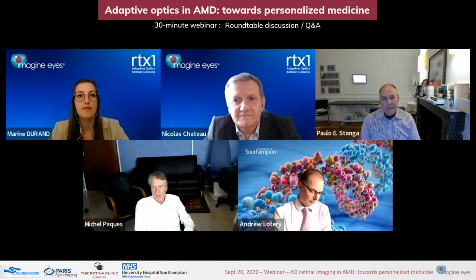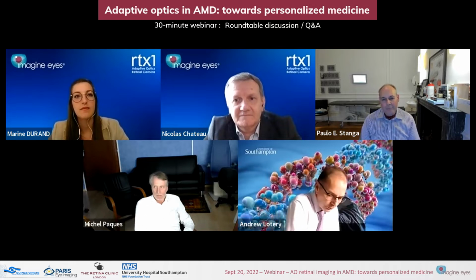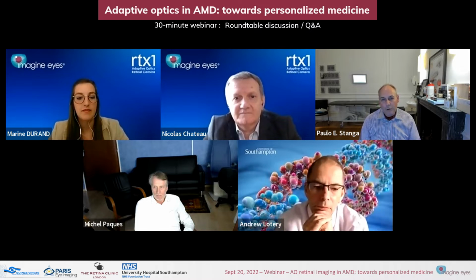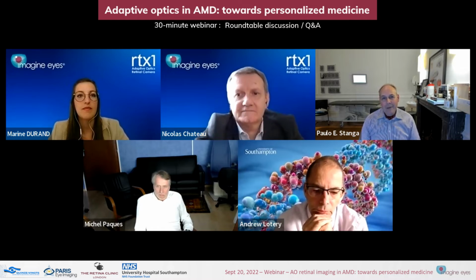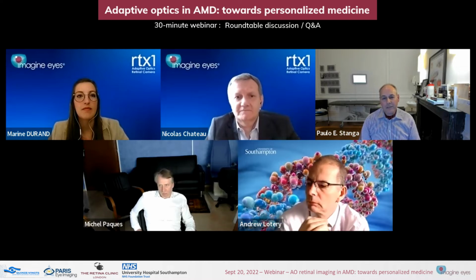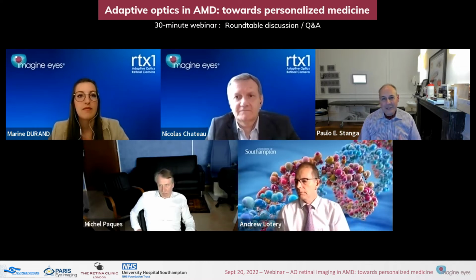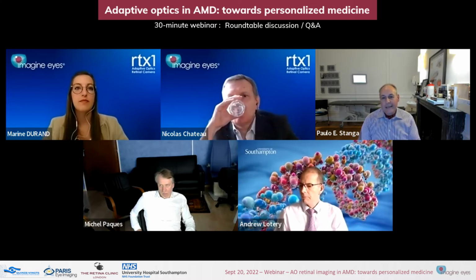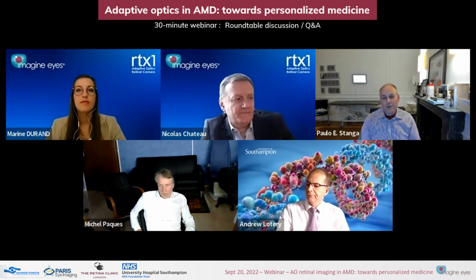Well, I believe that adaptive optics imaging can contribute new and complementary information to other ophthalmic imaging techniques such as ultrawide-field imaging, fundus autofluorescence, and even high-resolution OCT. All of these technologies should form part of a comprehensive eye examination, in my opinion. The goal is to reach diagnosis as early as possible. Adaptive optics allows us to perhaps detect changes earlier than OCT and fundus autofluorescence. And this could be an ideal tool for screening and monitoring disease.